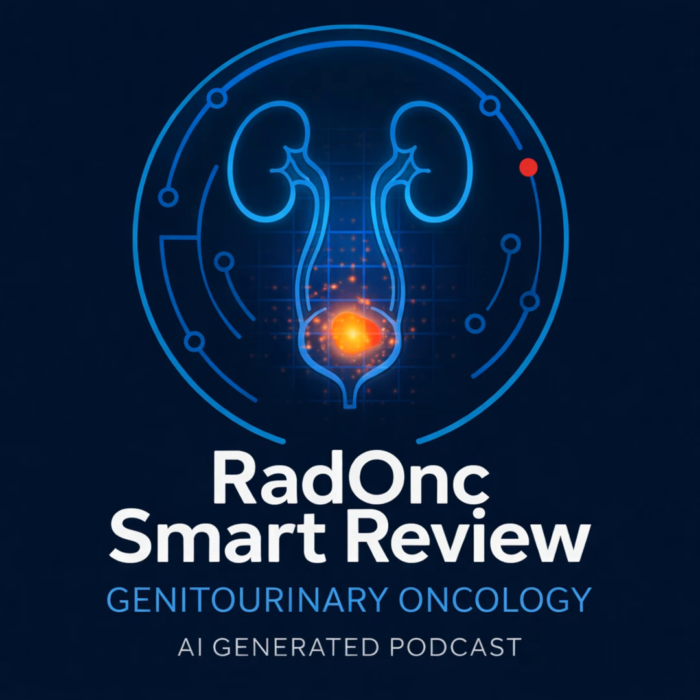Ideally, for a healthy patient, we might utilize deep inspiration breath hold, or DIBH. How does that work? We monitor their breathing, and when they take a deep breath in, they hold it. The diaphragm pushes the kidney down into a stable, highly reproducible position. We turn the beam on while they hold their breath, and we turn it off when they exhale. It effectively freezes the target in space.